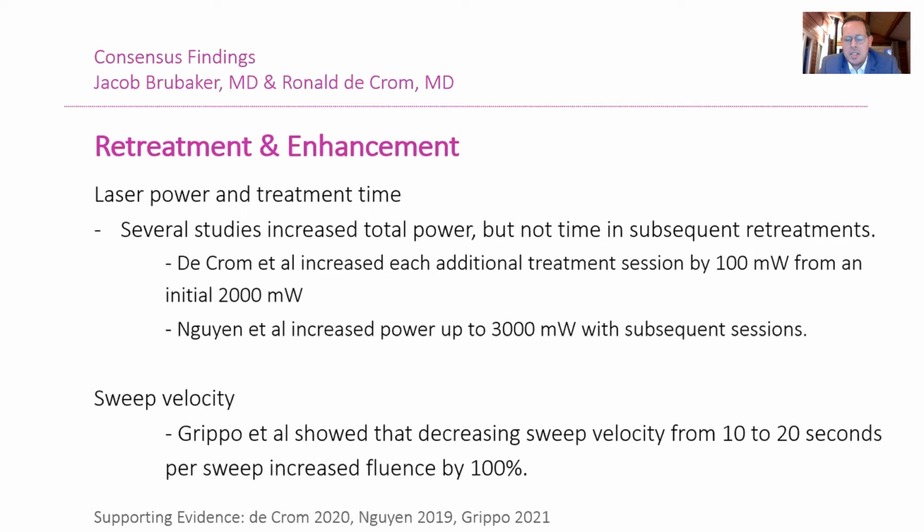In regards to the settings already described in the different studies, we know that in the studies in which retreatments have been performed, if we look at the laser power and the treatment time, several studies used the same power and the same treatment time during a retreatment, but also several studies increased the total power, but not the time, in subsequent retreatment. In our own study, we increased the treatment power during a retreatment session, and again increased the power a little bit more with subsequent sessions of retreatments. Both were performed with the original probe.